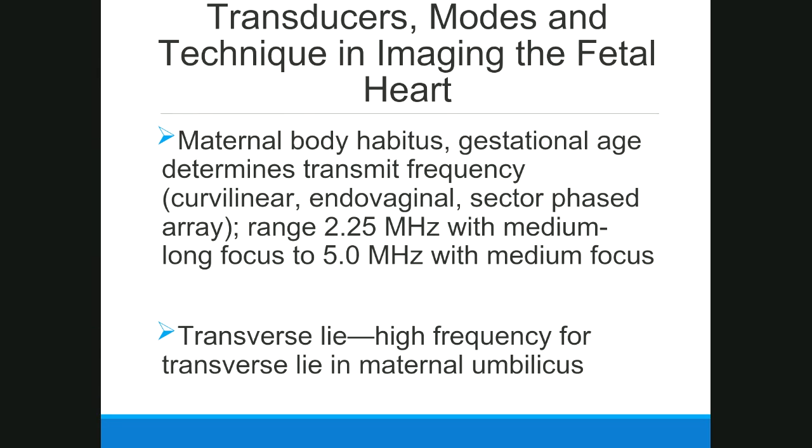All right. So in terms of the technique for imaging the fetal heart, it's not an easy thing to do. There's a reason fetal echo has its own credential. It's a lot of work, and it's very complex work imaging the fetal heart. And there's a lot of barriers that can hinder your ability to image the fetal heart well. So maternal body habitus is going to first and foremost be your biggest issue. Unfortunately, some patients have a more difficult body habitus than others, and it can make imaging the fetal heart difficult.